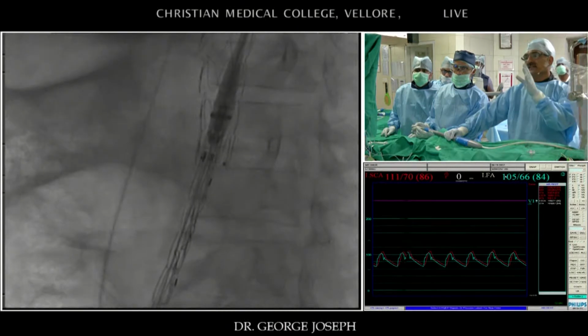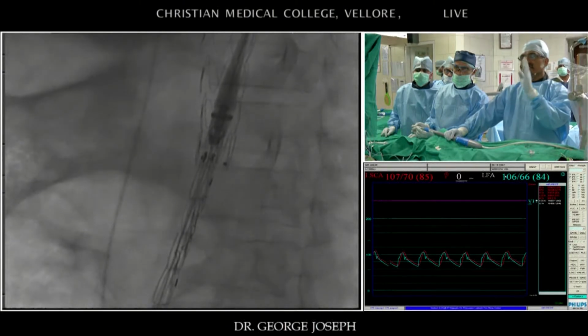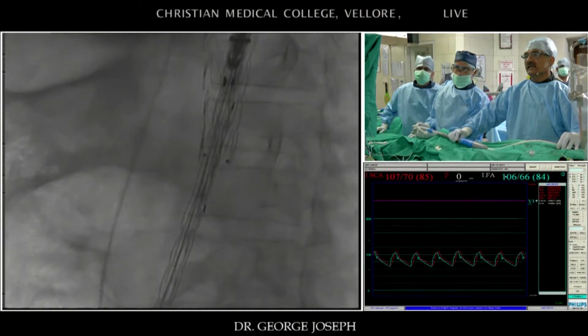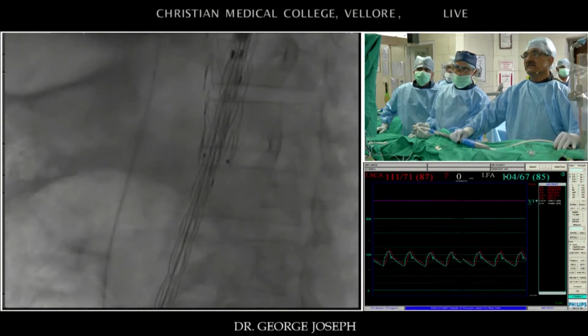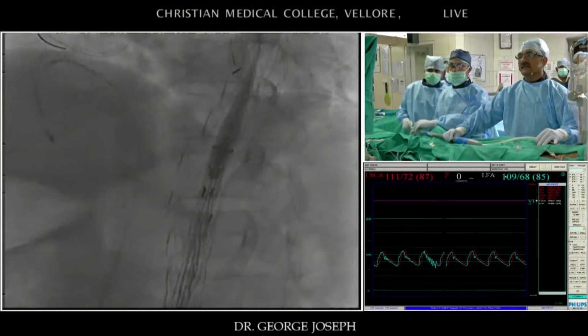They are actually figures of 8, but because I'm seeing them end on, they look like vertical lines in the LAO 57 view. So that tells me that my 12 o'clock line is oriented laterally in LAO 57. Okay, I'm going up, slowly going through this graft.